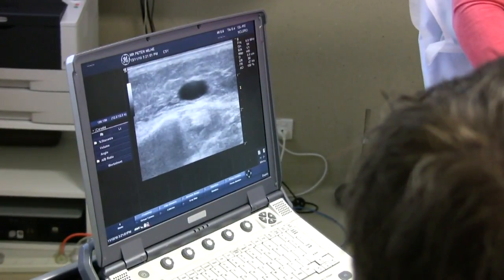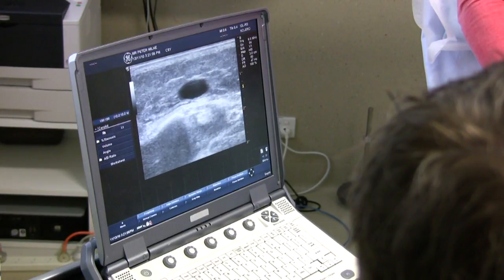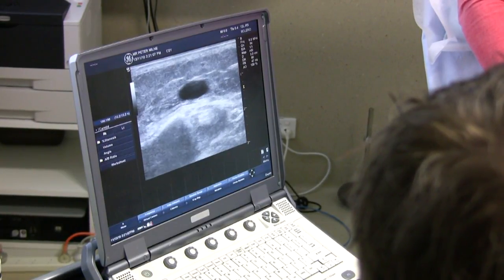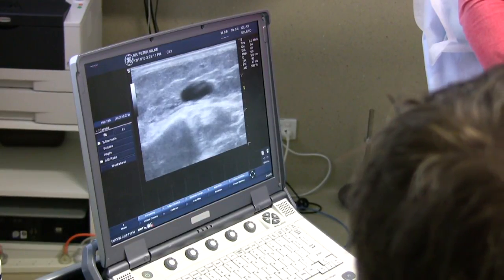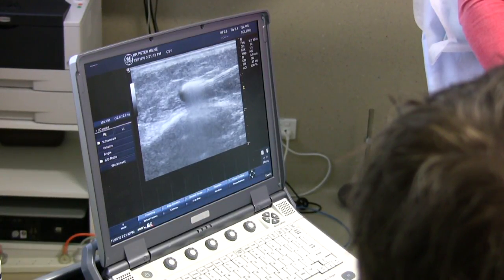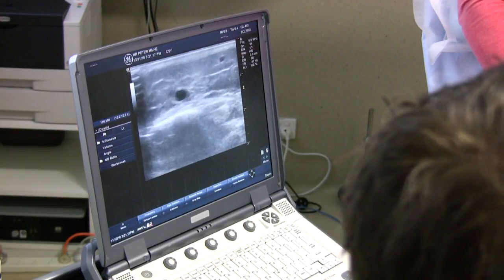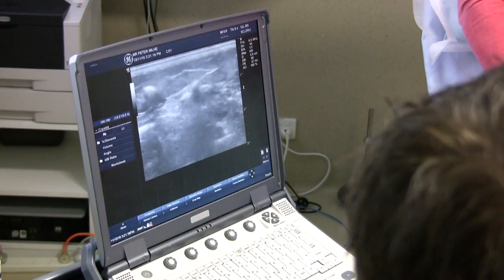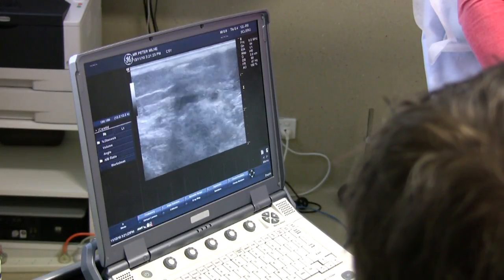The ultrasound imaging here shows how the needle is introduced under direct ultrasound guidance, and you can see the needle approach the varicose vein, enter the lumen, and then the appropriate foam sclerosant is introduced into the vessel, which spreads to the remaining draining varices, as you can see by the white foam percolating through the varicose veins on the imaging.